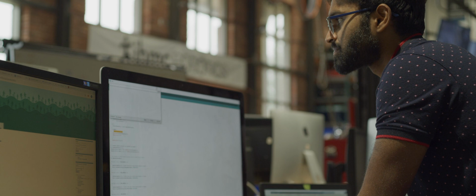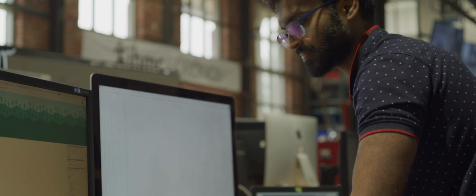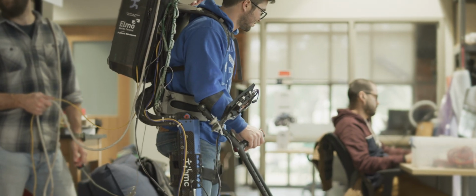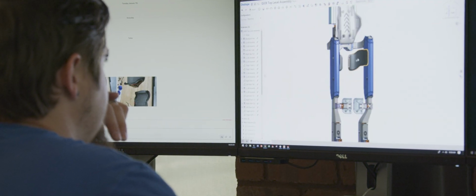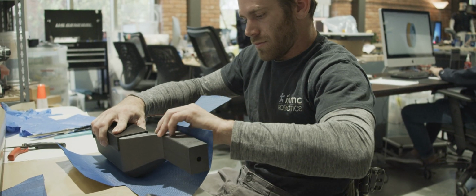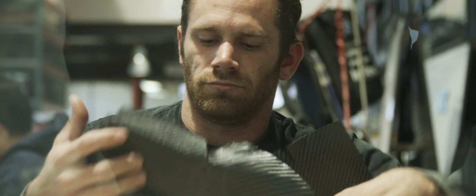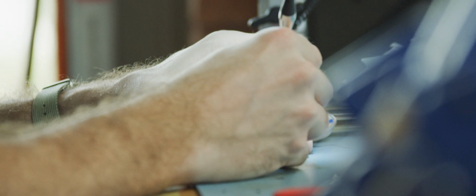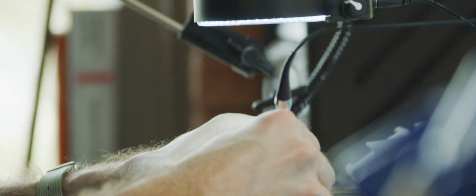So here on the Quix project, we have all of the different portions of the exoskeleton. There's Vishnu who's been working on the fabrication and design of the feet. Brandon has been working on the user interface and the crutch. I've been working on the mechanical design and all of the structural components. Mark's been doing all of the carbon fiber fabrication. He's been prepping the molds, prepping all of the carbon materials and doing the bagging. And Travis has been doing the electronics and wiring.